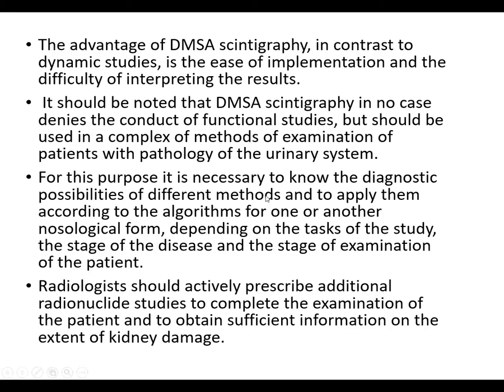The advantage of the DMSA scintigraphy in contrast to dynamic studies is the ease of implementation and the difficulty of interpreting the results. It should be noted that DMSA scintigraphy in no case denies the conduct of functional studies, but should be used in a complex of methods of examination of the patient with the pathology of the urinary system.